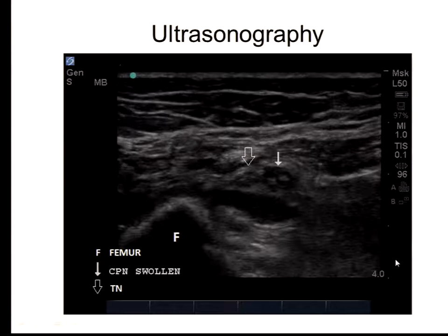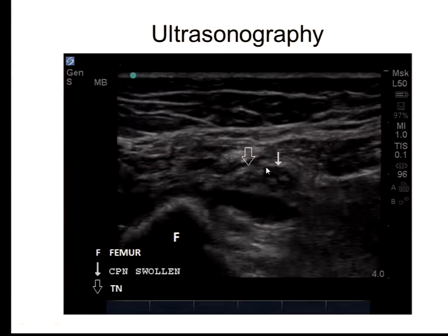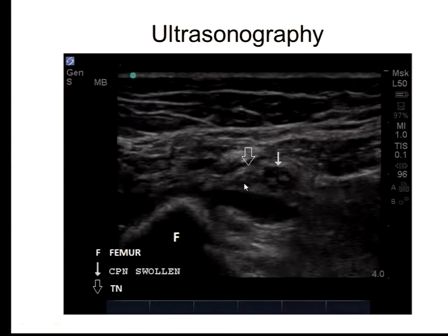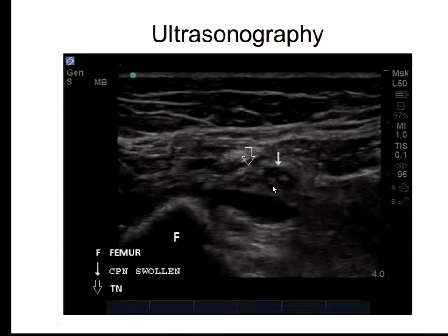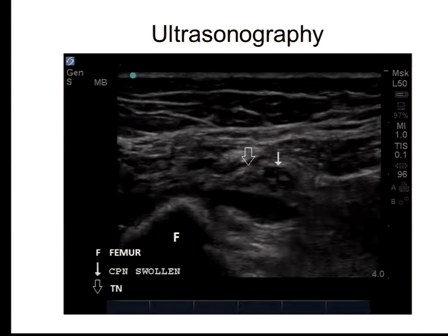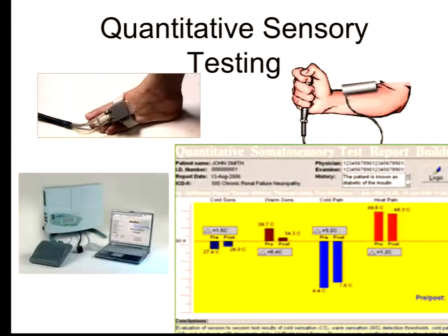For example, ultrasound: this is a picture of a patient with ischemic damage of the common peroneal nerve. You can see the actual split — the tibial nerve is normal, but this nerve is swollen and has actually lost some fascicular structure. It's nice, but sometimes you cannot see such gross changes of the nerve.